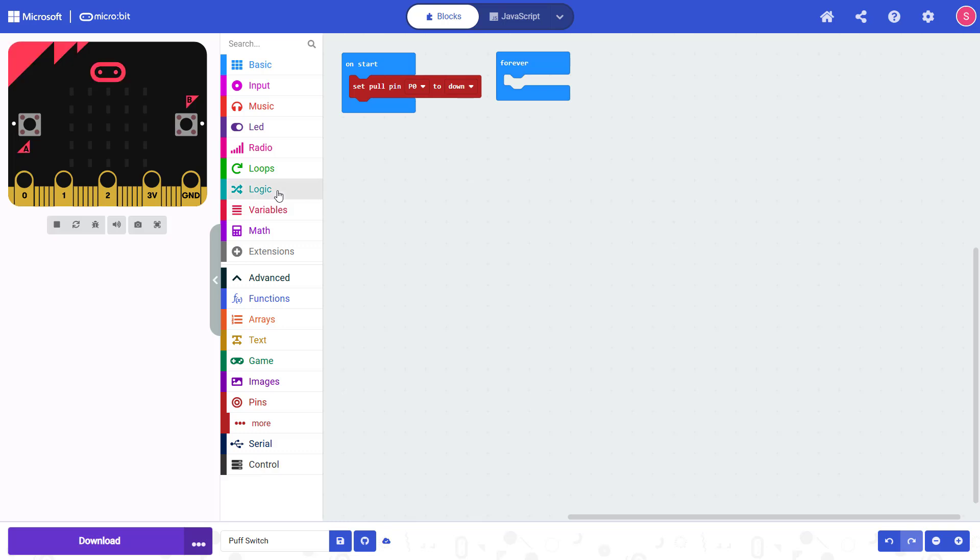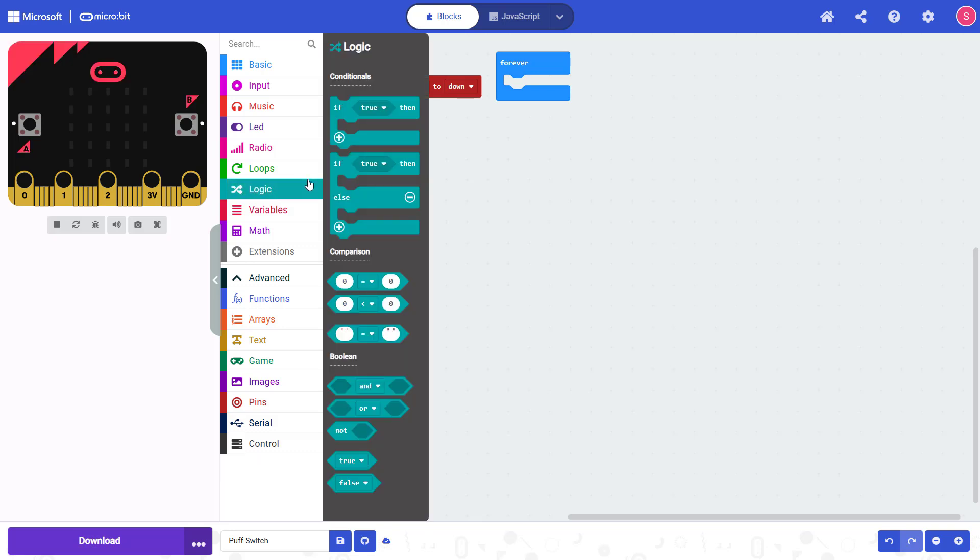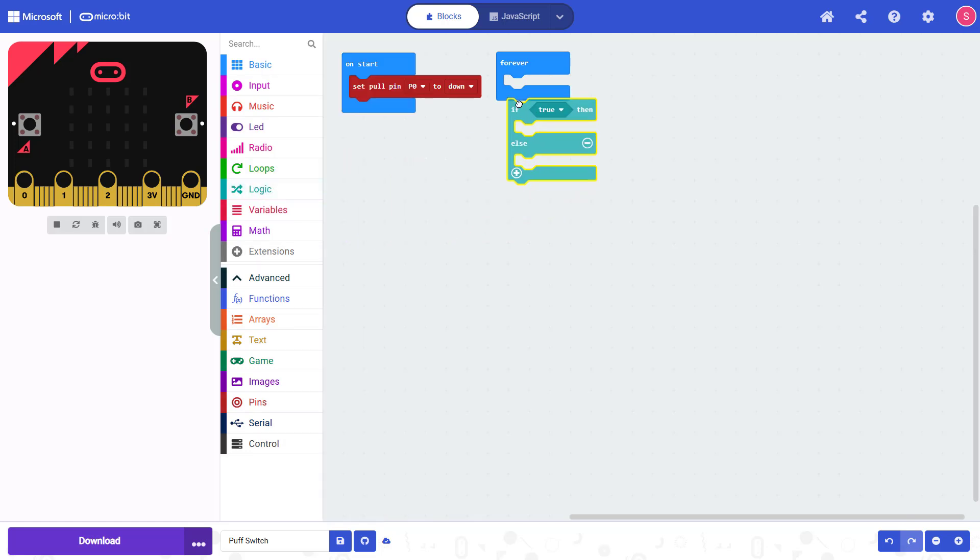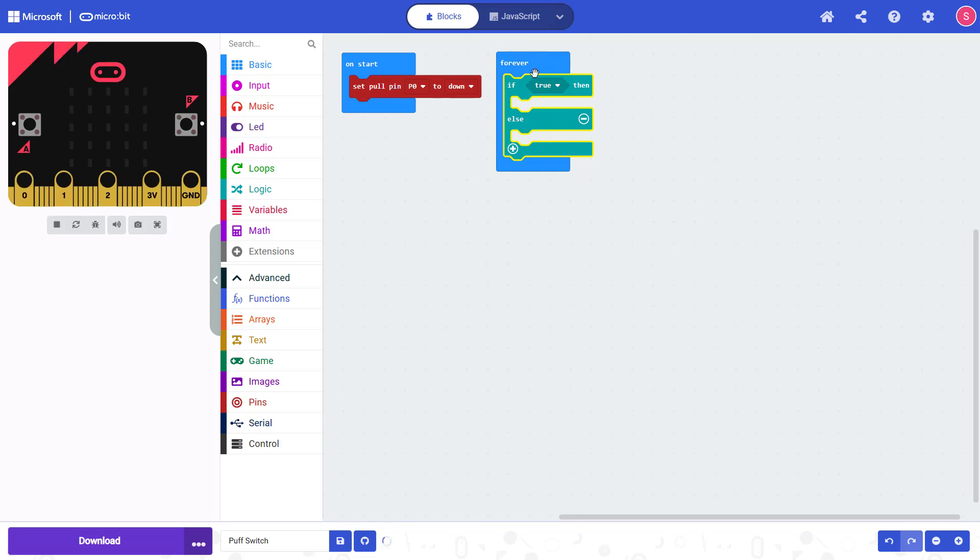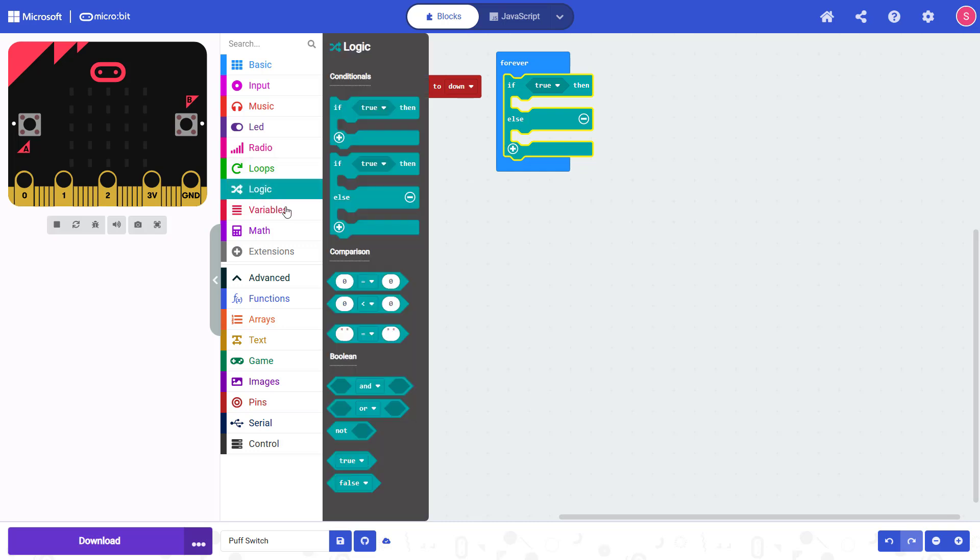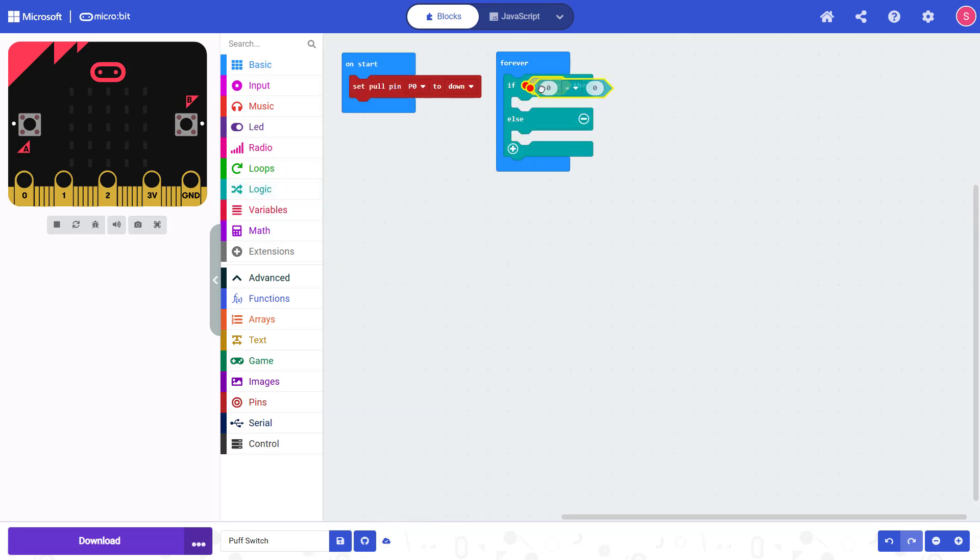Next we're going to go up here to Logic and grab an if-else statement. Drag that out and snap it into the forever block, because this is something we want the code to keep doing over and over again, not just once at the beginning of the program. We want to check if some condition is true, and the condition we're going to check is if the value on pin zero is high or low. So we're going to go into Logic again, drag out an equals comparison.